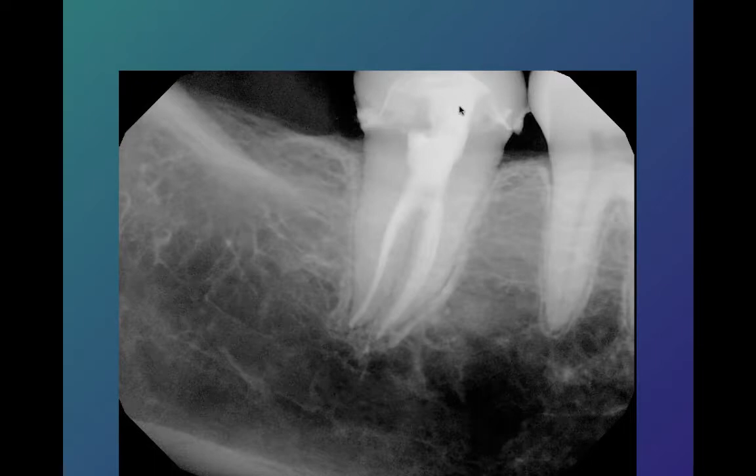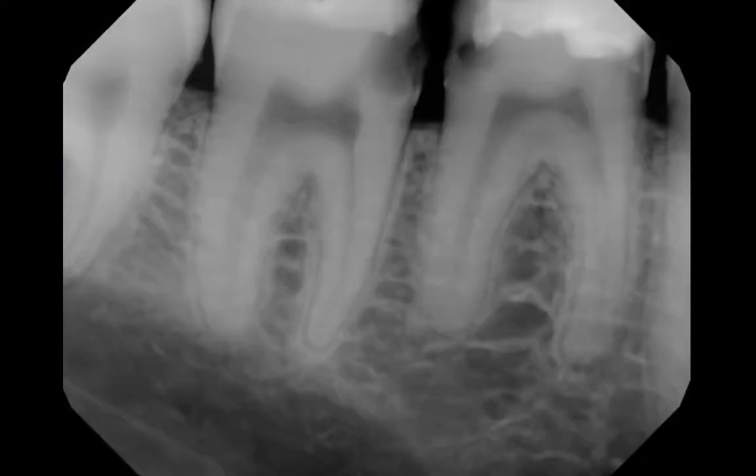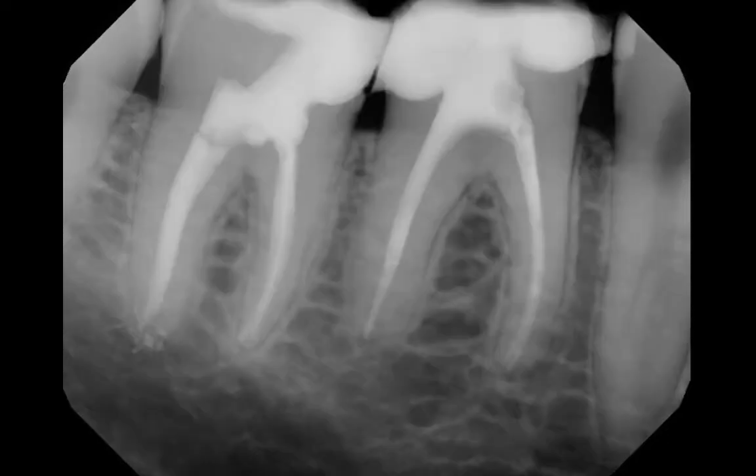Here we accessed more from the mesial. We really didn't need to unroof this to have good access into all these canals and do our job of cleaning and shaping. We like to be somewhat opportunistic in our access, and it's nice when we get cases just starting out rather than retreatments, because we can preserve a lot of this dentin by using the existing decay to get into where we need to go. Then we can flow our buildup into this area and preserve all of this dentin, which offers a lot more structural integrity from those buccal-lingual forces.